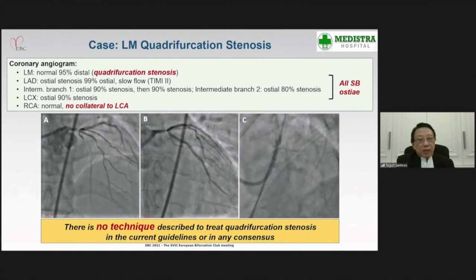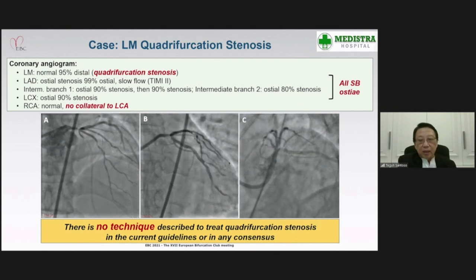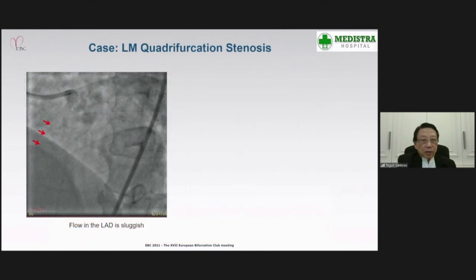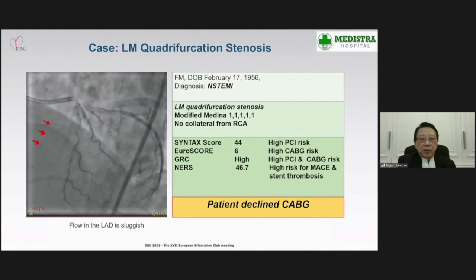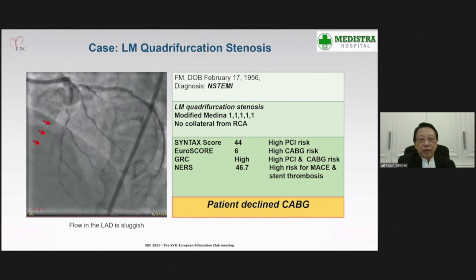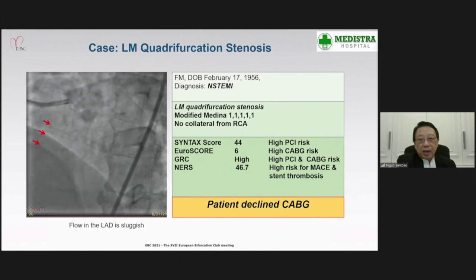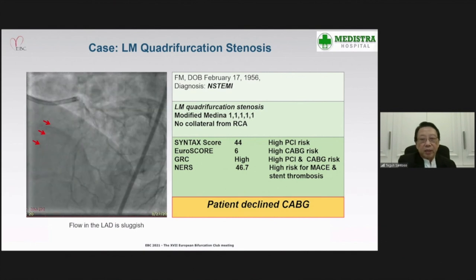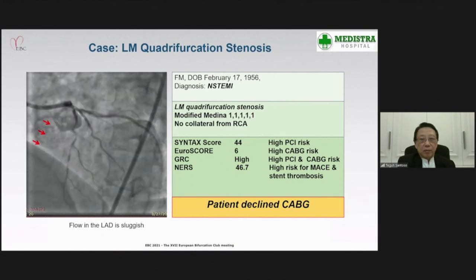You know that there is no technique described to treat quadrifurcation stenosis in the current guidelines or in any consensus. So we tried to apply the risk stratification models, SYNTAX score, EuroSCORE, GRACE, and NERS scores, and we concluded that the patient was at high PCI risk, high CABG risk, and he also had a high risk for MACE and stent thrombosis. However, the patient declined coronary artery bypass surgery.